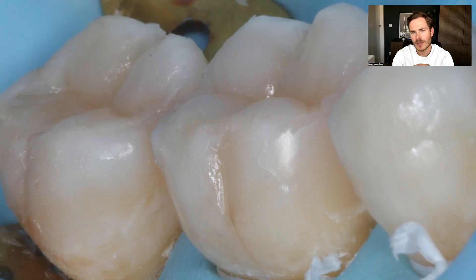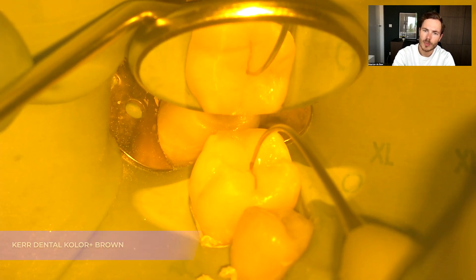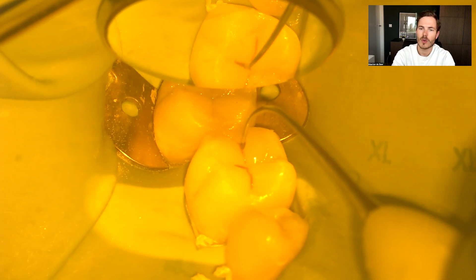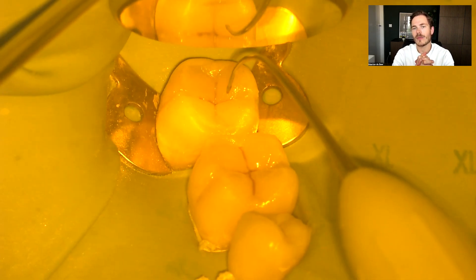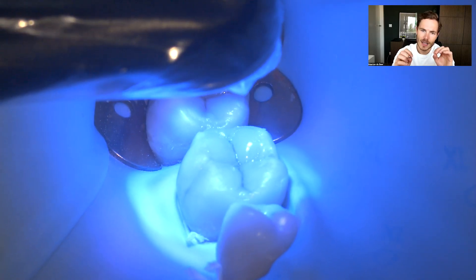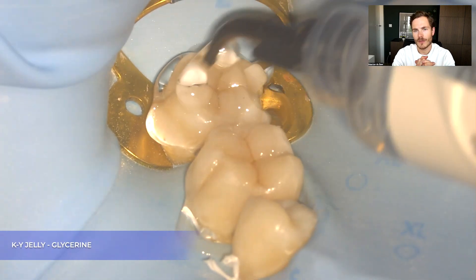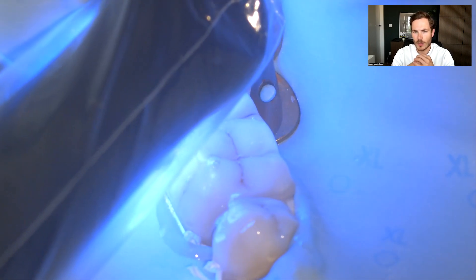This is the final result, but to give a little more depth to our restoration we use a tint to characterize the fissure. In this case I used the Color Plus Brown by Kerr Dental to highlight the fissure. It's always important to use a stain or characterization material that is very runny and flowable, because we want it to go into the deepest parts of the fissure — it also seals any tiny gaps between layers and highlights the deepest part of the restoration. I then use clean micro brushes to remove the excess, leaving only the material in the deepest part of the fissure. The final step is applying glycerin to make sure everything is completely polymerized, and then we can start with the polishing of the restoration.